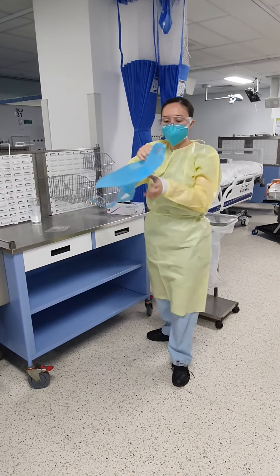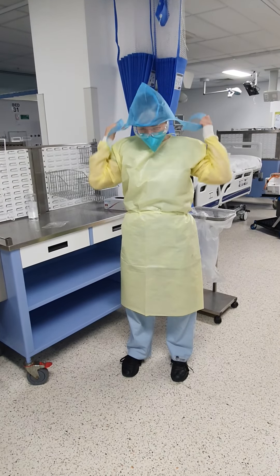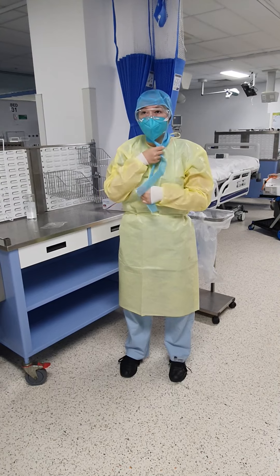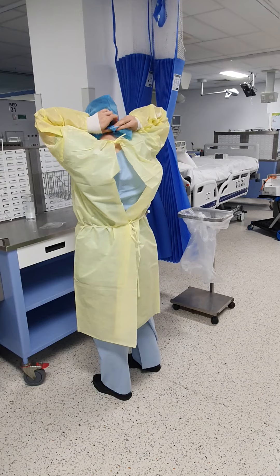Next step is head cover. Go get a head cover and keep moving it up. Push your hair back, wrap it around the front, go to the back, and tie it at the back.